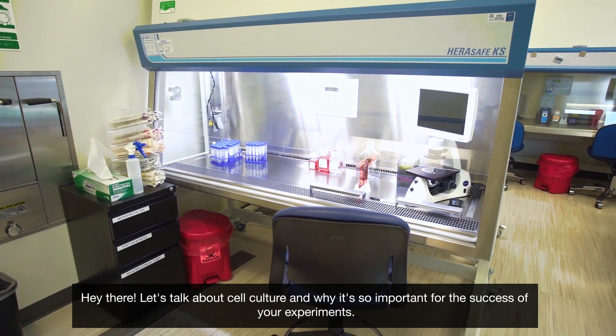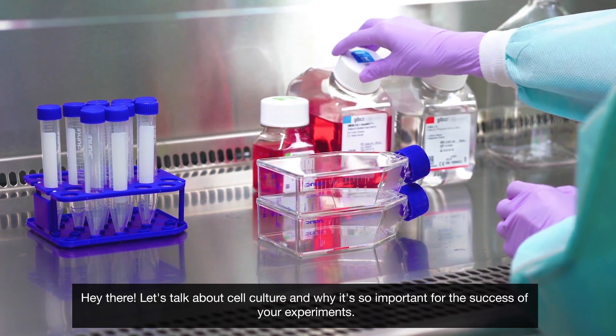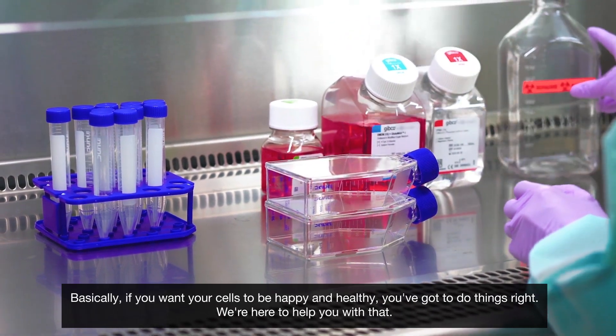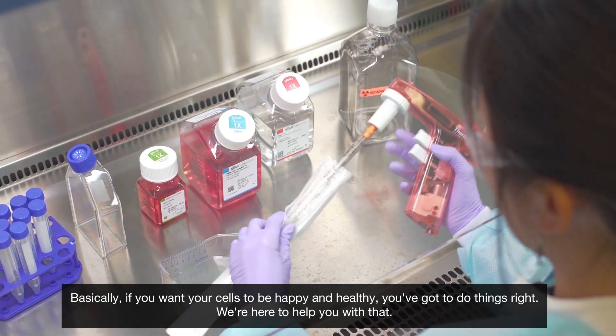Hey there, let's talk about cell culture and why it's so important for the success of your experiment. Basically, if you want your cells to be happy and healthy, you've got to do things right. We're here to help you with that.